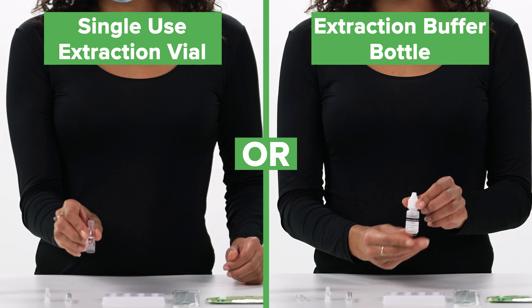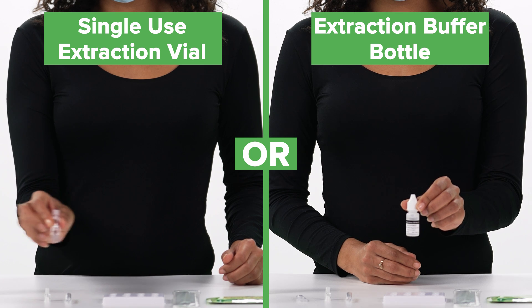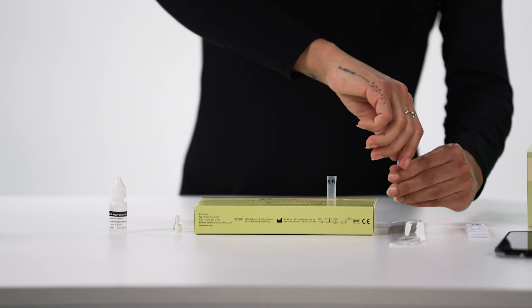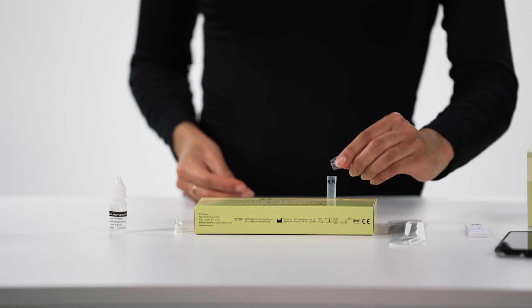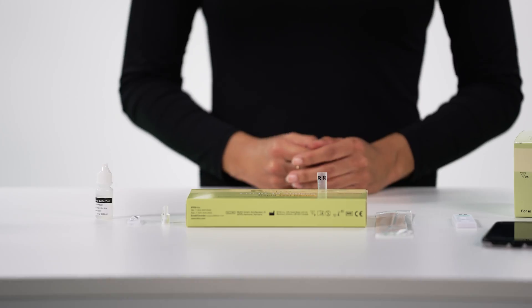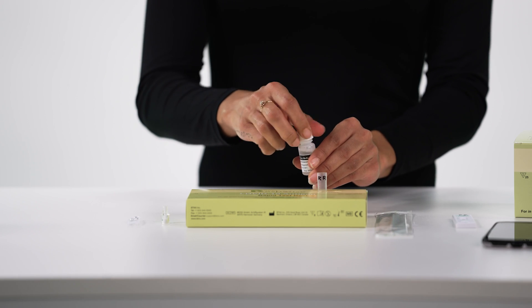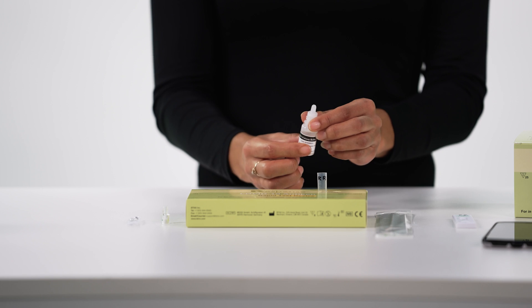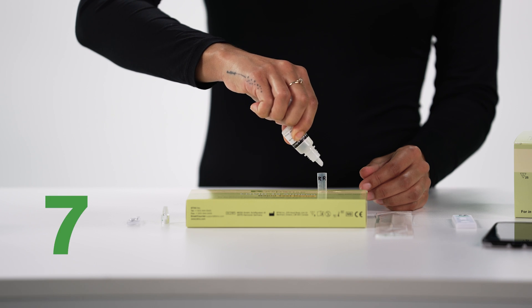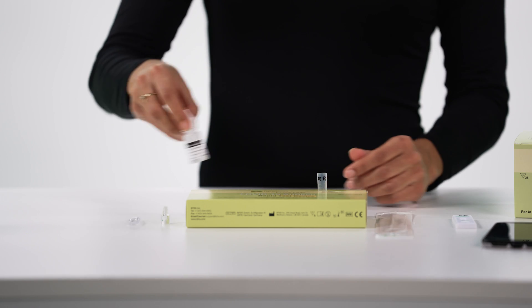Depending on the type of kit you have received, you will be using either an extraction buffer bottle or an extraction buffer vial. To use the single-use extraction buffer vial, twist open the tag of the vial, then empty the entire contents of the vial into the extraction tube. To use the extraction buffer bottle, gently mix the bottle, then open the cap and add 10 drops of the buffer to the extraction tube in your tube stand. The test procedure is the same for those who have used the extraction buffer bottle and the extraction buffer vial.